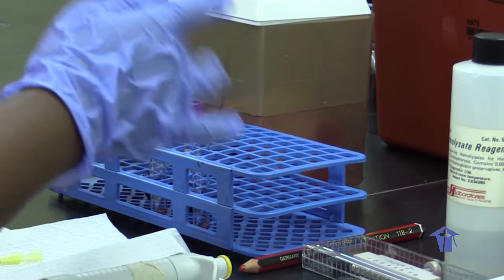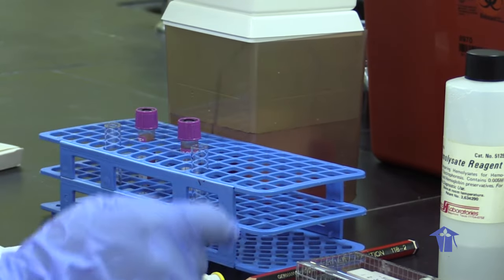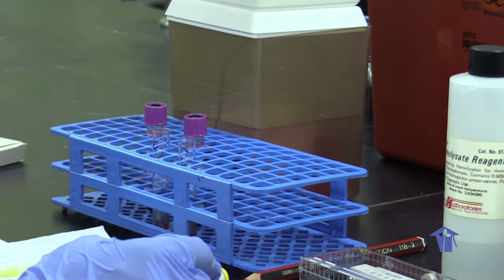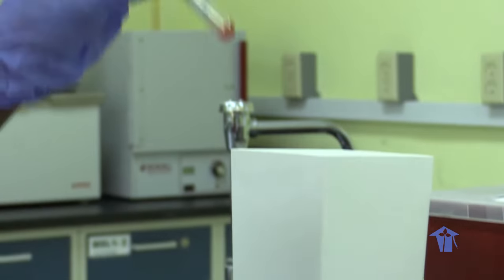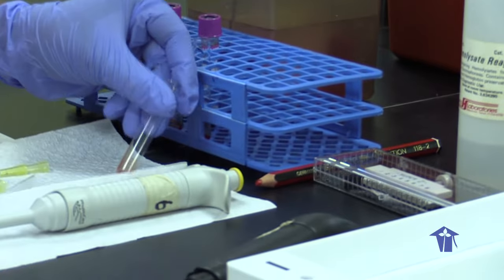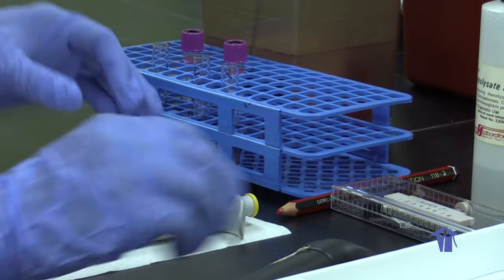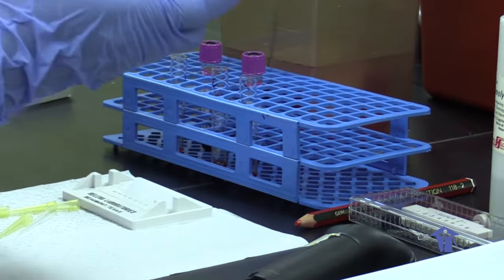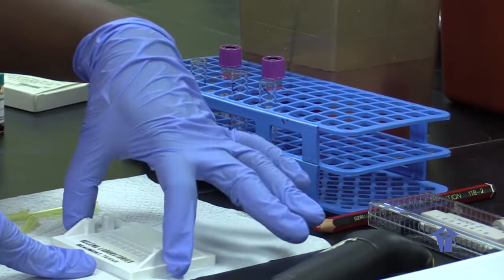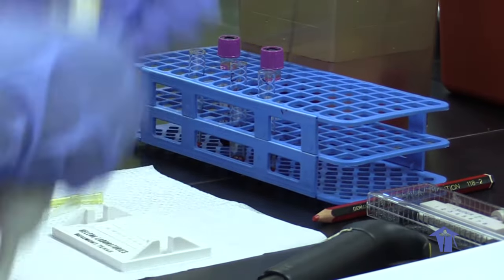So now we have our diluted whole blood samples. As you can see, it's immediately starting to lyse the sample. It's becoming a bright cherry red in color. So already the hemoglobin is being released. Then we want to put it in the wells. This is where we place the blood sample and take it up to put onto the plates.